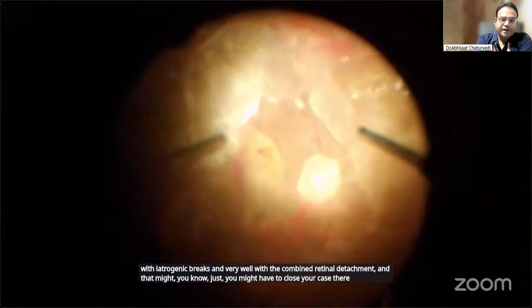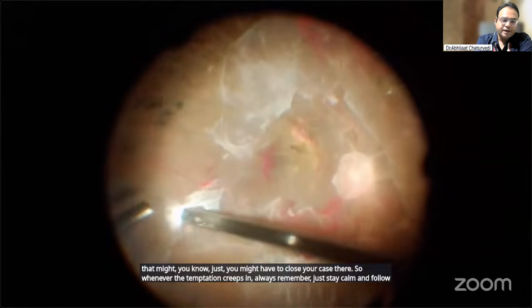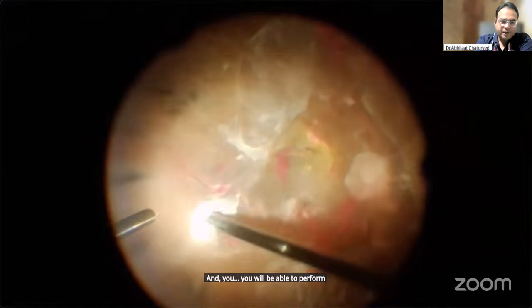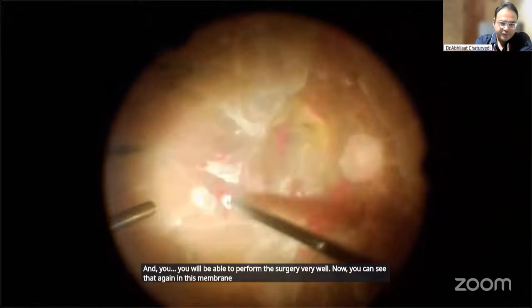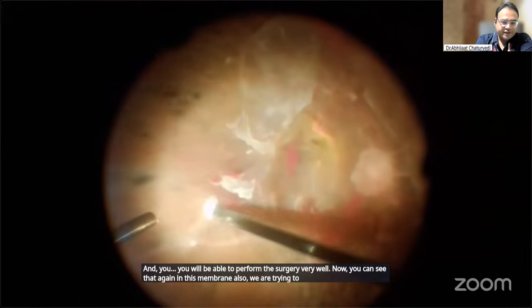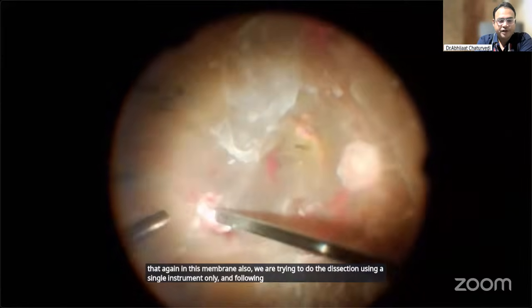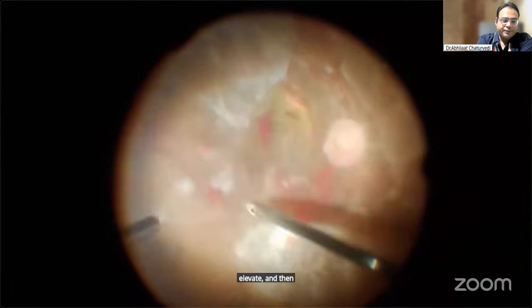So whenever that temptation creeps in, always remember, just stay calm and follow your dictum, and you will be able to perform the surgery very well. Now you can see that again in this membrane also, we are trying to do the dissection using a single instrument only and following the same dictum. Just nudge, elevate, and then slightly eat up the membrane.